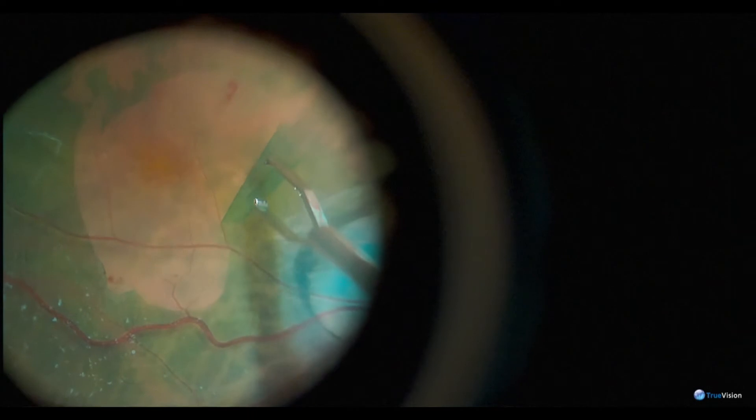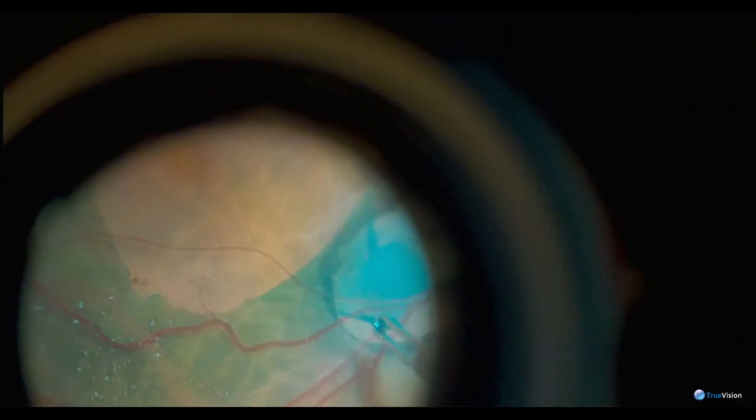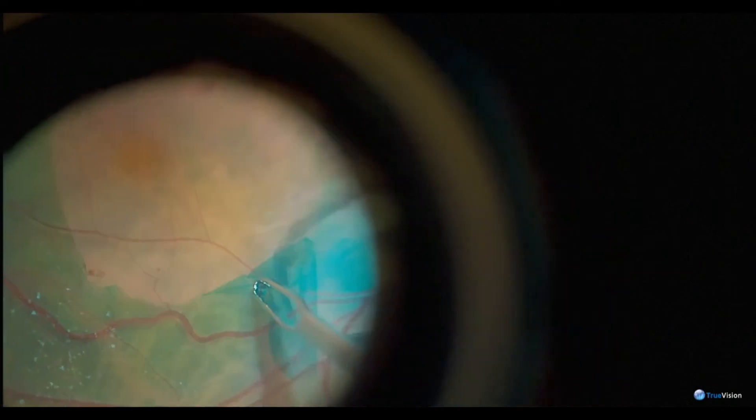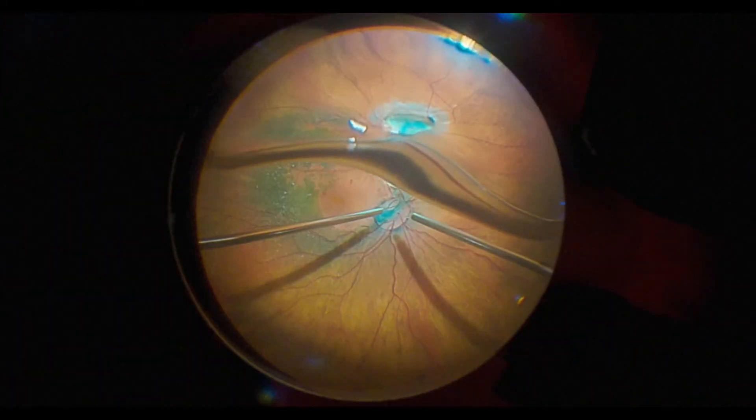We peel this ILM all the way off and actually take it over to try to get it adjacent to the optic disc pit, so that we can tuck it down into the pit.